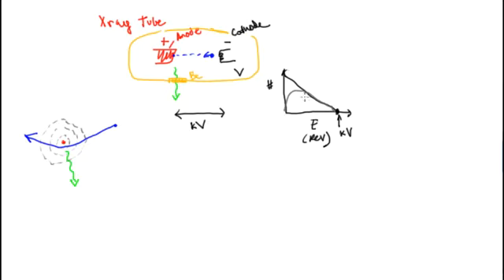That's a filtered spectrum going through the window, with fewer photons at low energies. Sometimes tubes have more filtration as well. So I'm going to draw another filtered spectrum here. This is what it might look like if we also send it through another filter. This might be aluminum or copper of some thickness. And as you do that, the mean energy of the spectrum shifts up. It hardens.